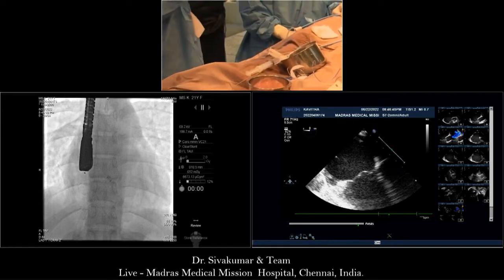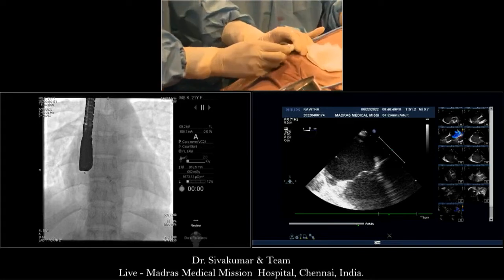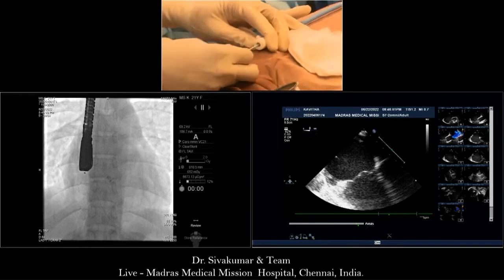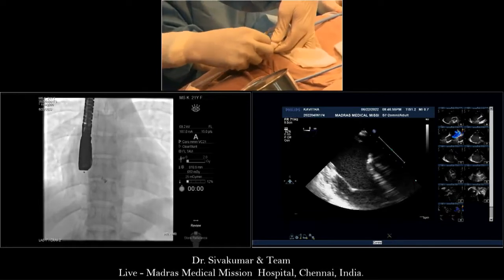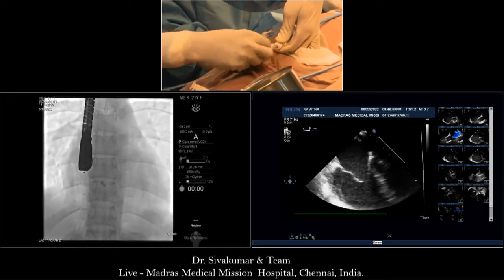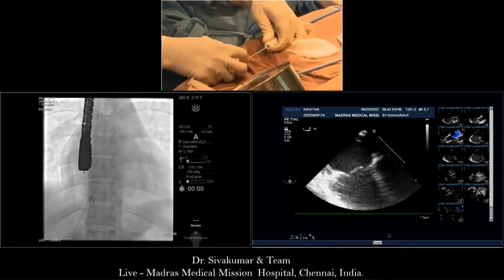Was it too small? Hands up for too small. Hands up for I'm too tired, I don't want to know anymore. Okay, right. Shiva, don't rush. You take your time. We're going to look at this beautiful result. Let's not distract him too much now.